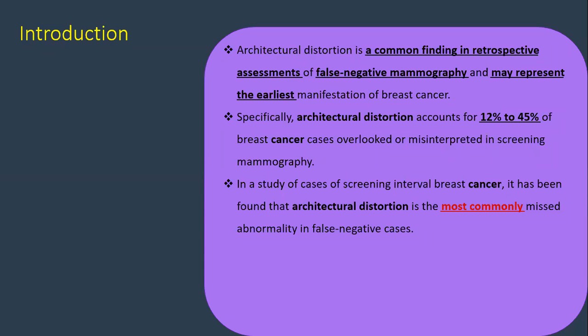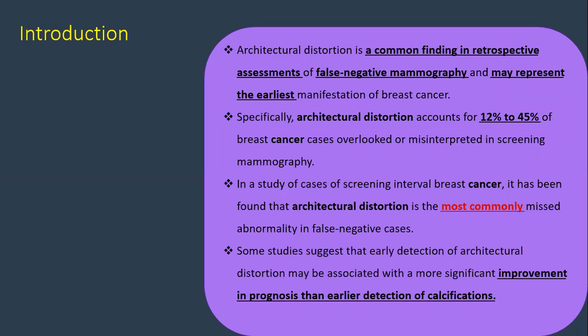Some studies suggest that early detection of architectural distortion is more important than early detection of calcification, because it gives a more significant improvement in the prognosis of breast cancer.